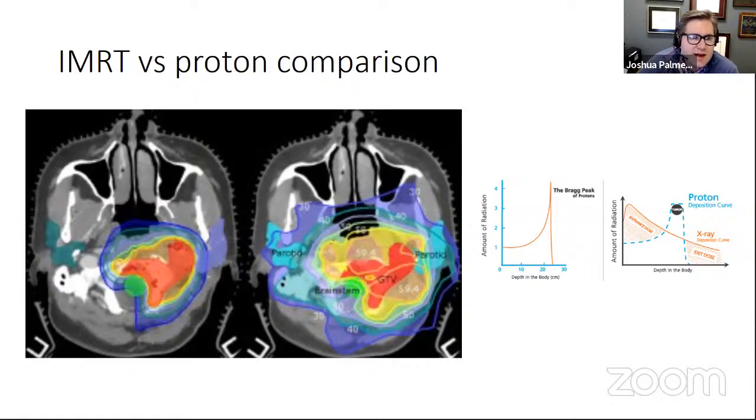You see that with IMRT, a lot of the radiation treatment in lower doses gets sprayed throughout the body. With proton-based therapy, that dose distribution is much tighter. That low dose is spared throughout that part of the body. As a brief tutorial, pictured here on the right, the physical difference between proton therapy and photon therapy is that protons, based on their energy, stop in the body, allowing us to treat the tumor while things distant to the tumor don't get treated.